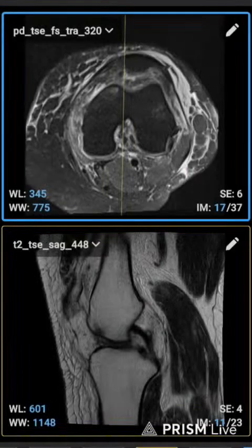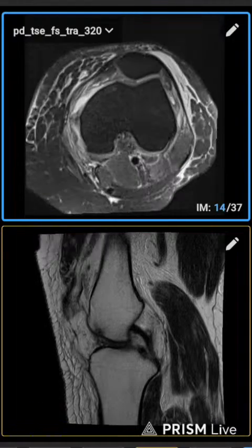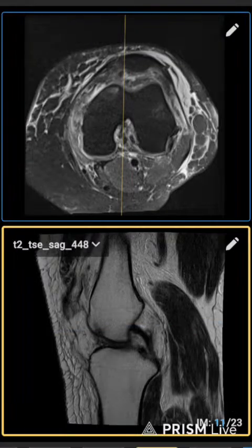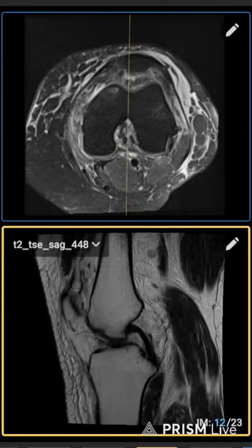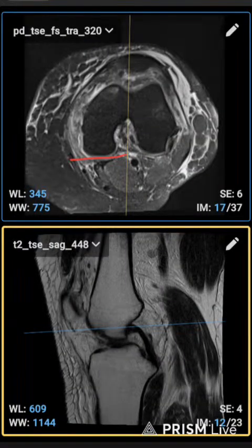You will find a line between the femoral ends on both sides, and the sagittal plane is 90 degrees to this line. Also you will see that the sagittal plane is properly 90 degrees according to the end of the femoral bone. So that's the sagittal planning. After that I will show the coronal planning.